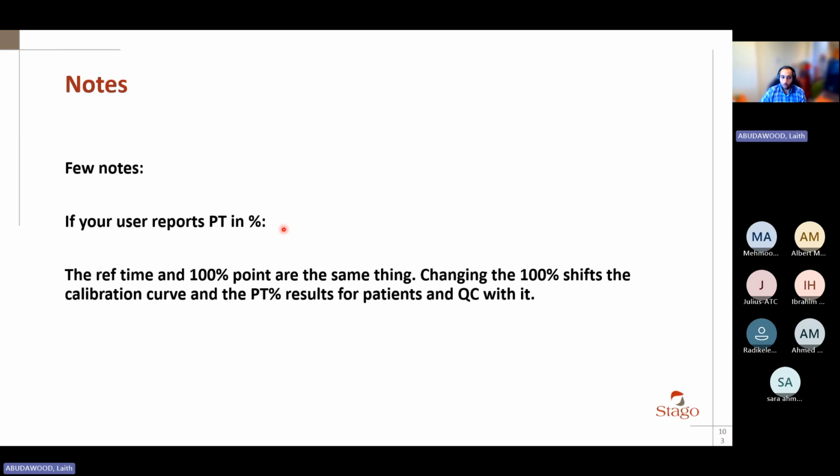Now, before I go into the notes, does anyone have any questions about calibration? Because of course, it's a very important topic. Yes, Ibrahim. About the calibrator. Can you explain why the measurement of uncertainty decreases down the line? I do know how, but if somebody asked me to explain, I don't think I will be able to explain it properly. You mean the uncertainty measurement increases?